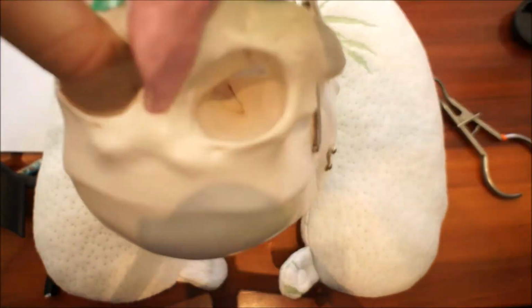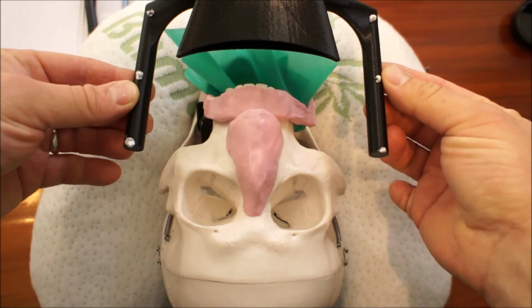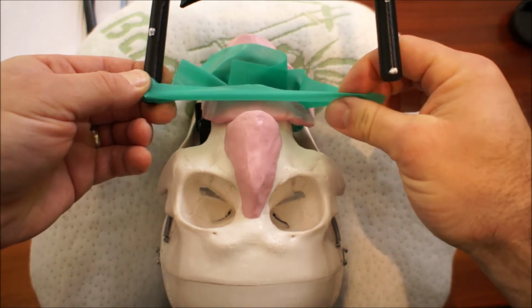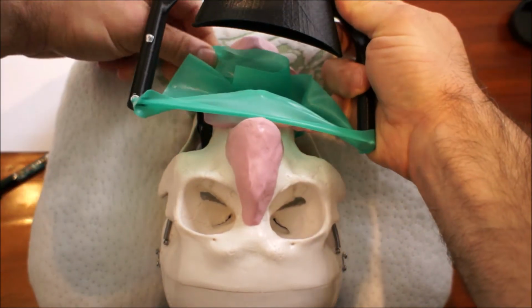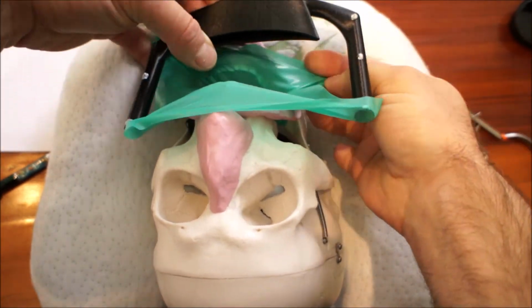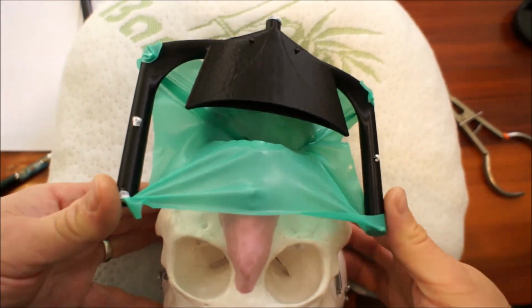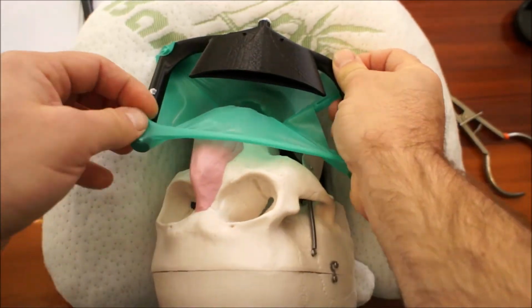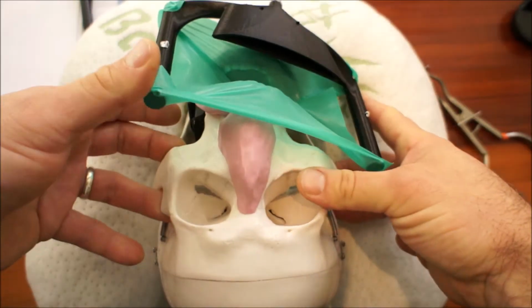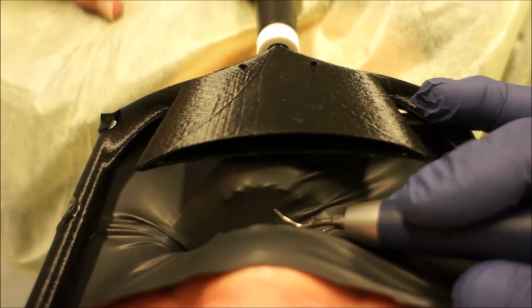But second of all, the fitment of the clamp first, and then fitting the rubber dam over the clamp is what I prefer, purely because I think it's safer. There's horror stories out there of people treating the wrong tooth when they do the fitment of the clamp to the sheet first. As you can see there, it doesn't really work on this skull. Bad position.